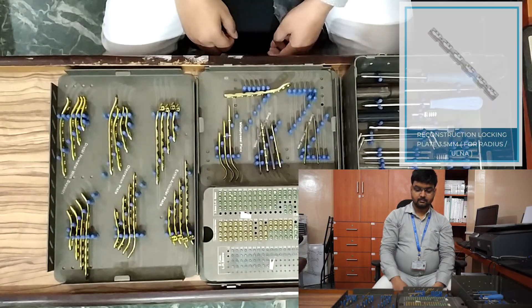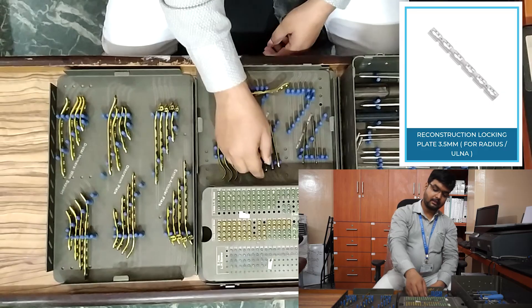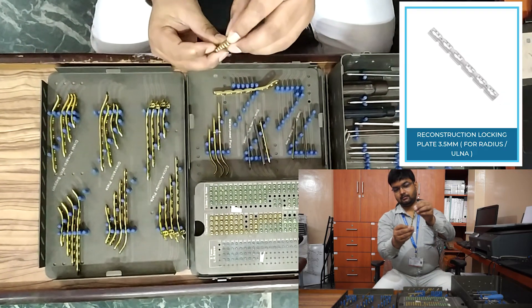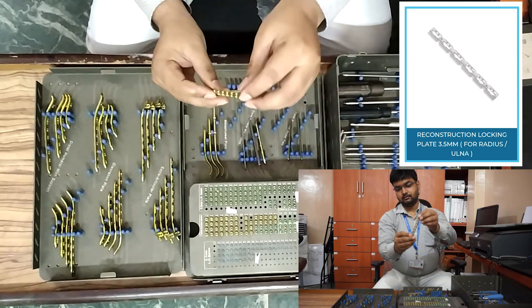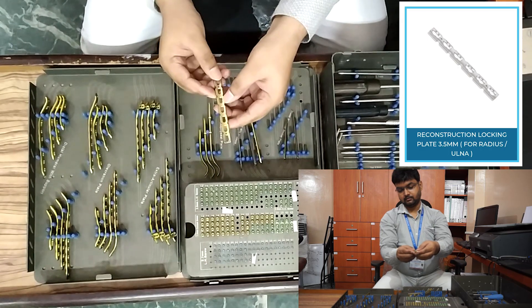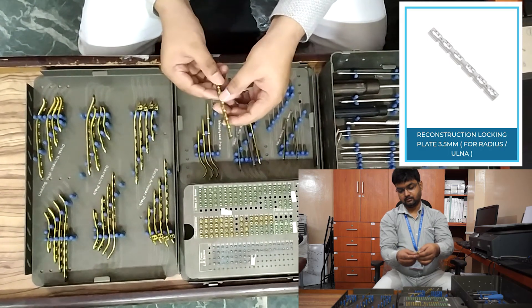Next, recon locking plate: five-hole, six-hole, seven-hole, eight-hole, nine-hole, and ten-hole. There are longer plates available, but this much is sufficient.